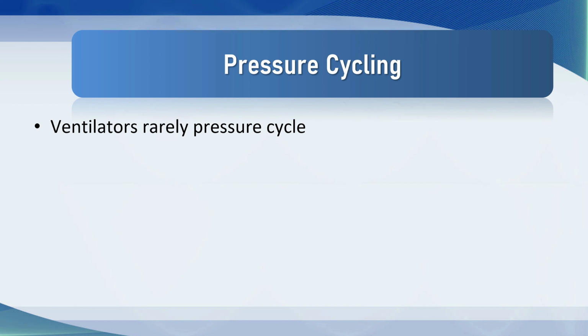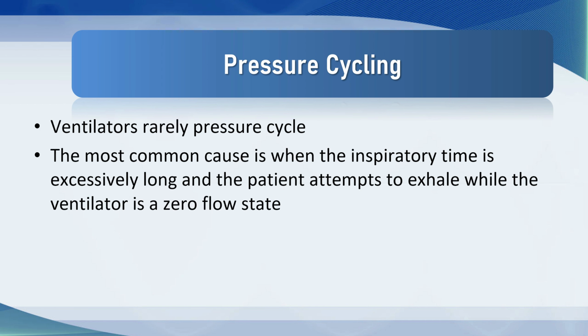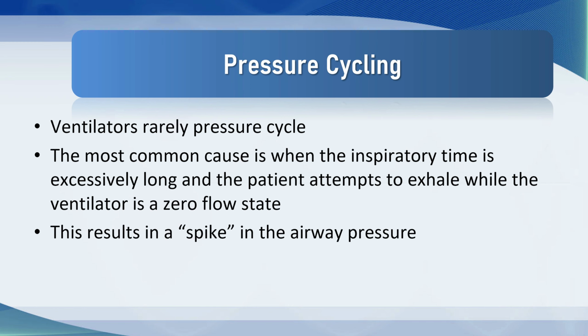On most modern ventilators, the most common cause of pressure cycling is when the inspiratory time is excessively long and the patient attempts to exhale while the ventilator is in a zero flow state. This results in a spike in the airway pressure.